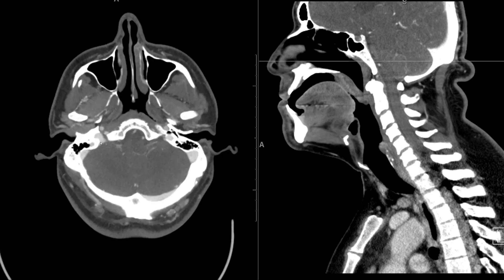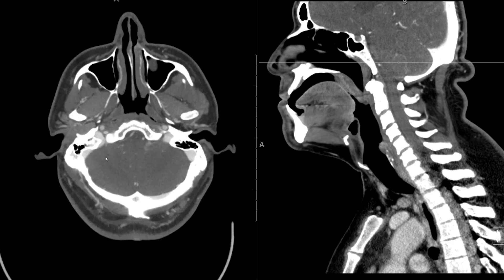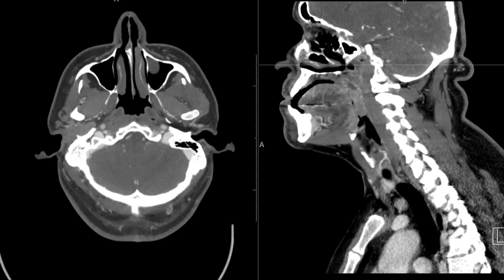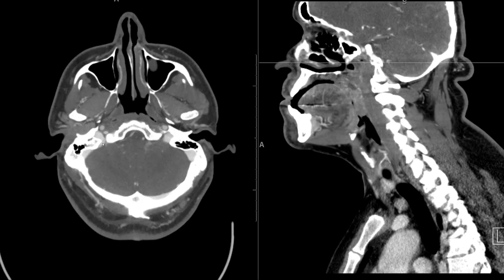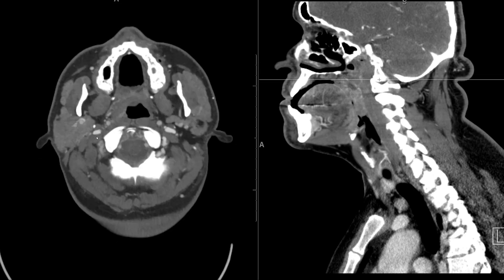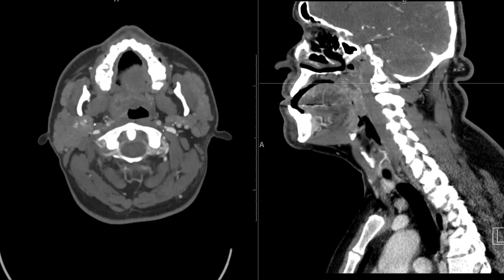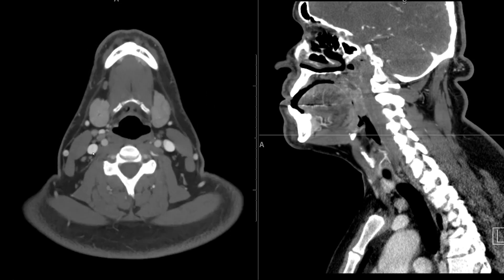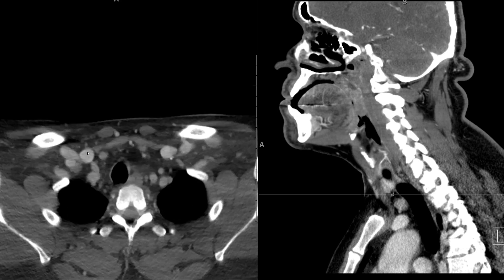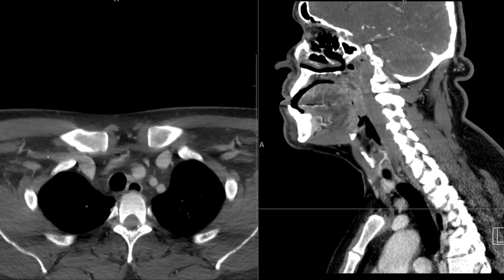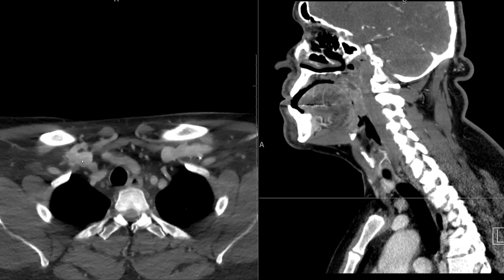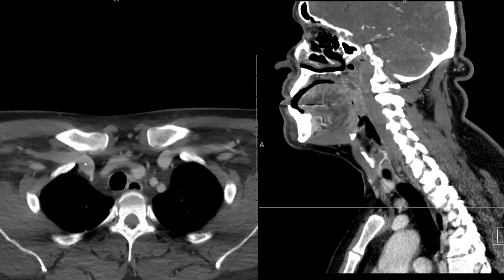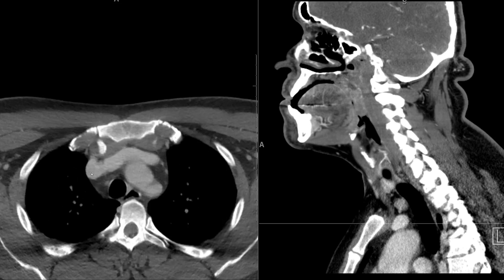Lastly are the veins. The internal jugular vein is formed superiorly at the end of the sigmoid sinus — the jugular bulb — and then continues inferiorly on both sides, filled with contrast, down the neck to join the subclavian vein and form the right brachiocephalic vein.